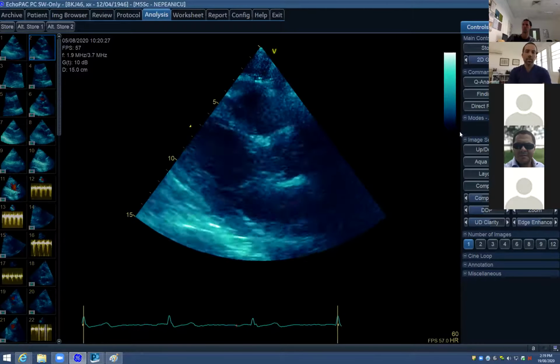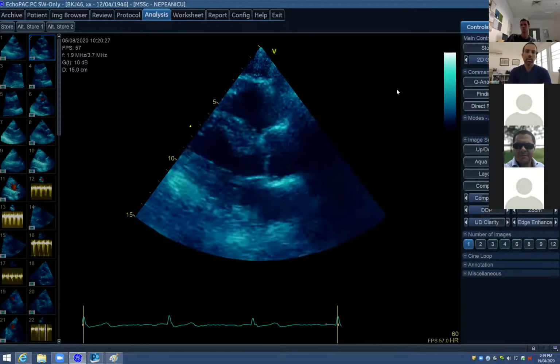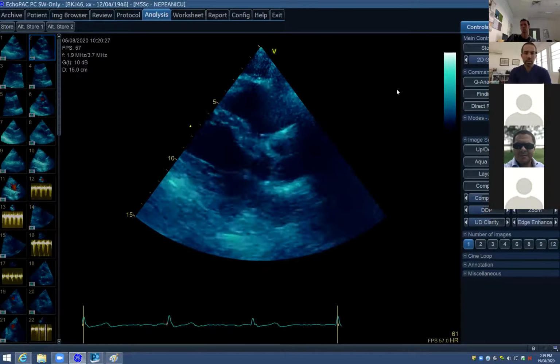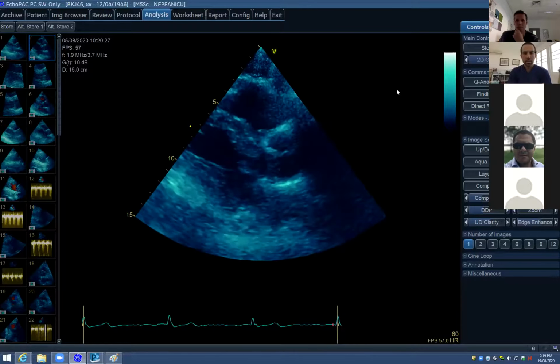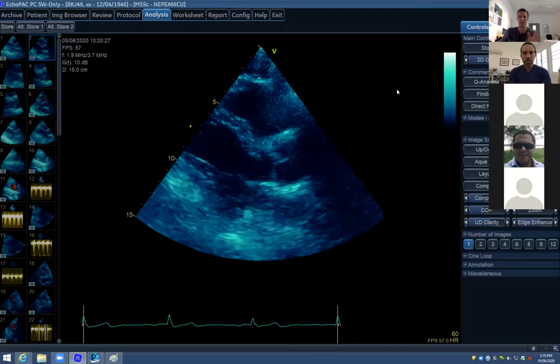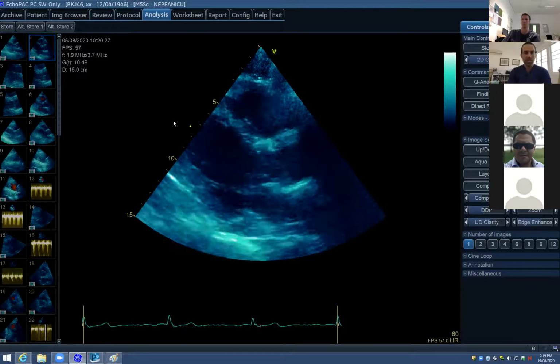And the RV in this view, I think it's slightly down, like if we went up a rib space, perhaps it'd be different, but the RV looks generous in this single view. Really nice. I like the idea of generous, and don't make any wild conclusions based on the parasternal long axis view. You said that very nicely, so beautiful.